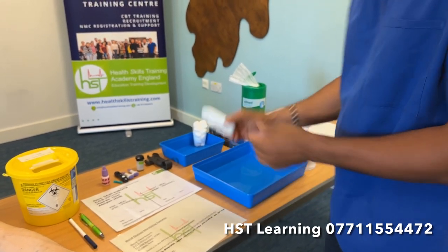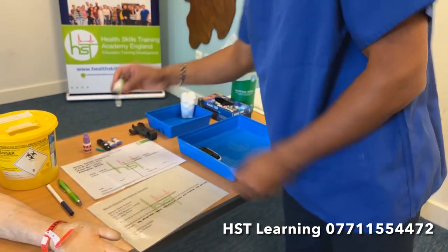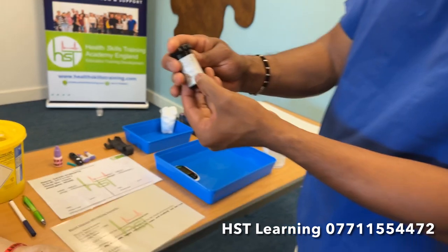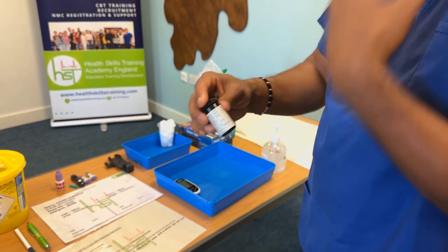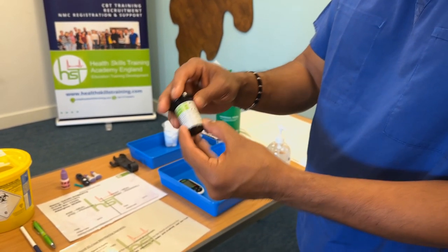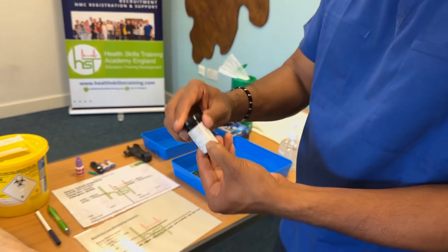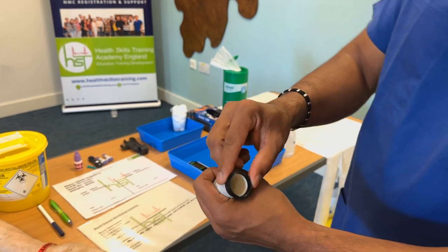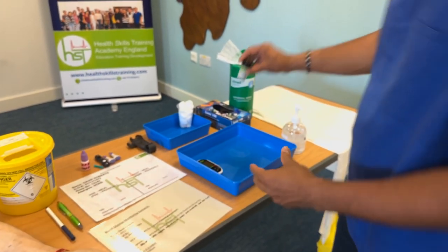The machine needs a strip. A common error is not recognizing the expiry date. If you look at this particular strip bottle, it's expired — expired in 2022. You need to acknowledge that and verbalize to the examiner. If the examiner says you are the nurse and you decide, there may be another bottle with the correct date. Pick the right one, open the strip, check whether it is in good condition — dry and clean — and verbalize that.